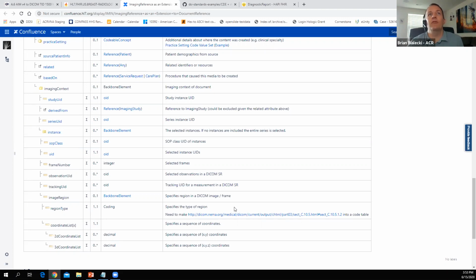And I think that's part of what's gone on with radiology reporting in general. Not to beat up my own here, but I think that's where AIM was really starting to go. AIM is calling out every time I drop a point, I'm going to describe why I dropped it on the screen. But what AIM missed was, a normal chest x-ray is actually an observation. Well, if I didn't draw anything, I didn't have an annotation image markup. And that's being corrected now.